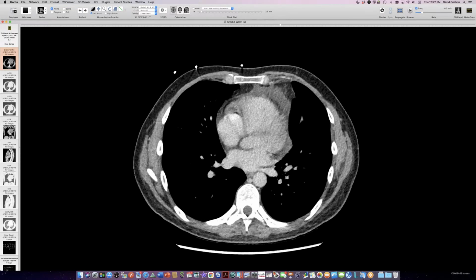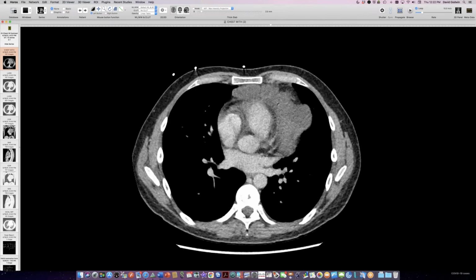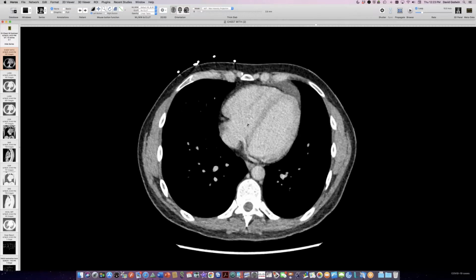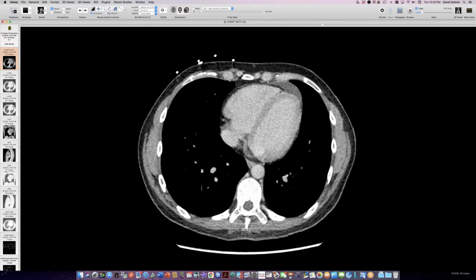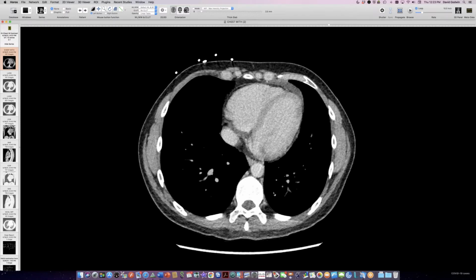And I think currently, with a larger mass, there is now a pleural effusion. The other finding is that there is a pericardial effusion now. So this mass may be involving the pericardium and may have invaded the pericardium. And on the current CT now, a month later, the pericardial effusion is larger, and he does have now some chest pain. So the chest pain could be coming from the pericardial component. So this mass turns out to be a Ewing sarcoma.